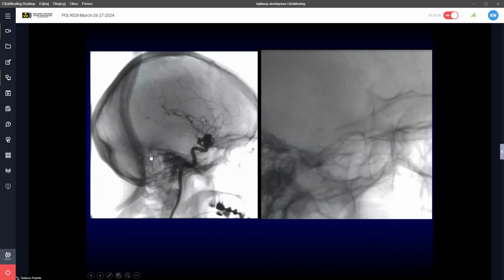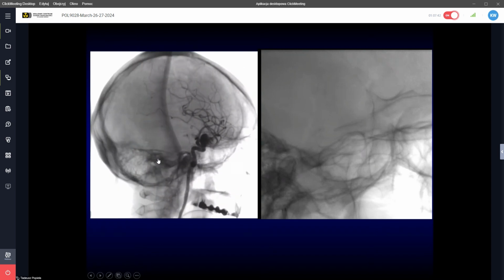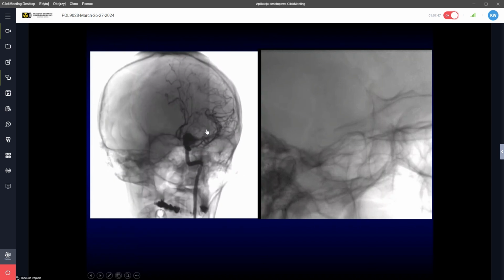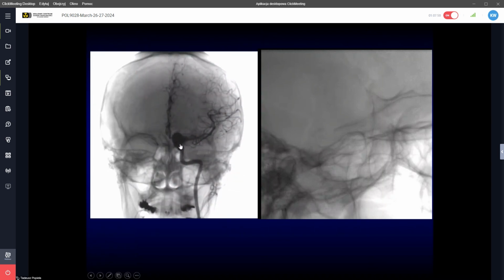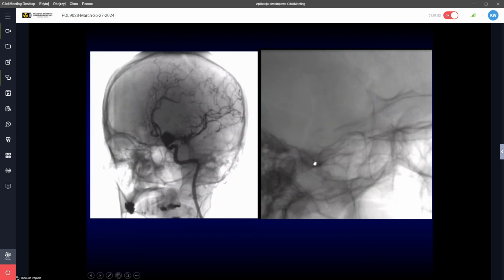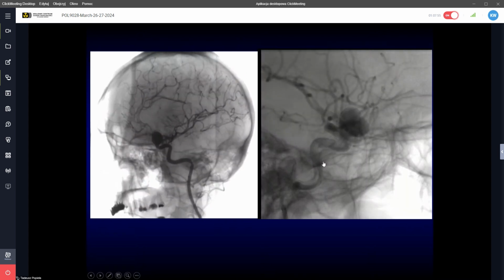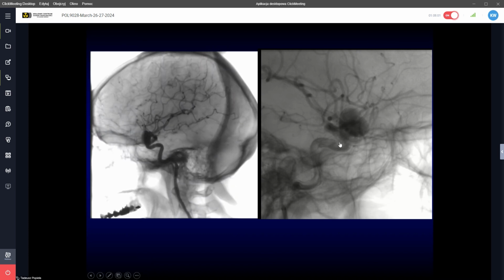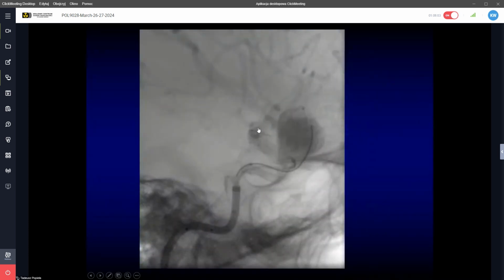And there's the case with the stent. This stent has a structure which is sometimes tough to see. This is why we will use the non-subtracted images. There is again a quite big circular-shaped aneurysm on the distal part of the internal carotid artery on the left side. So we choose the best projection to see the junction point. You can see that there is a distal marker of the microcatheter, which is inside the aneurysm sac. I hope you see this red point.